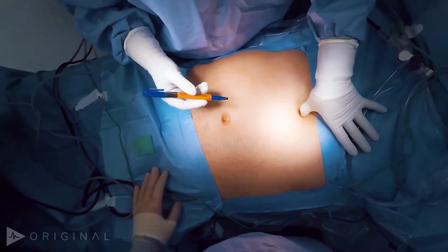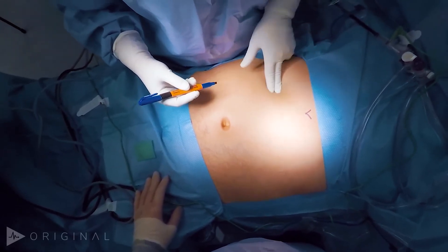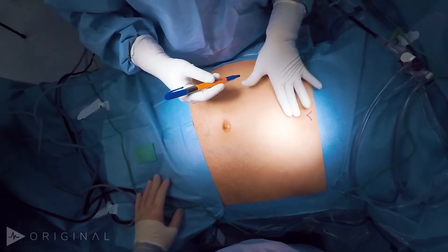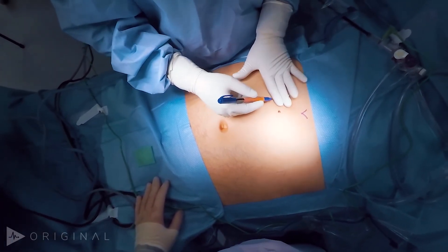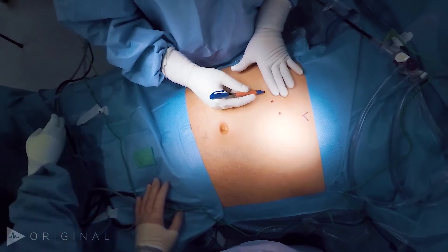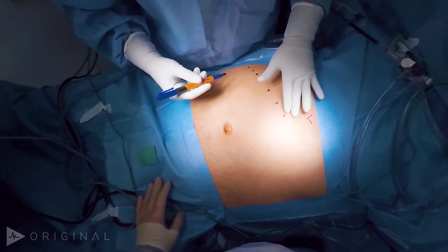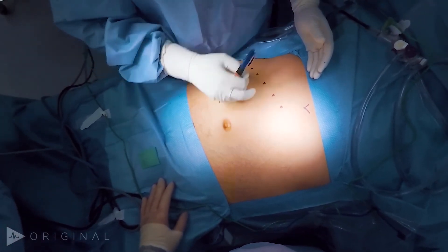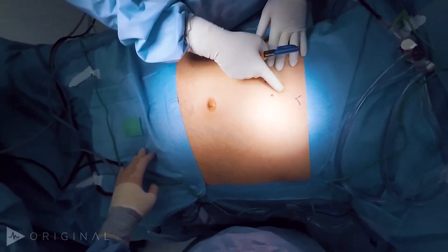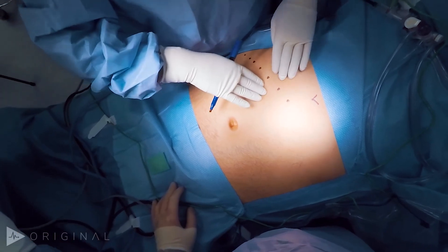So his xiphoid is here. You can see the midline at the bottom of his rib — about two finger-breadths below the right subcostal margin — I just mark out where we may have to open. Now, if the patient has a lot of compliance when we insufflate, this may drop down and the actual line of port placement might be a little higher on the patient. You don't want to do this after you've insufflated because it distorts.